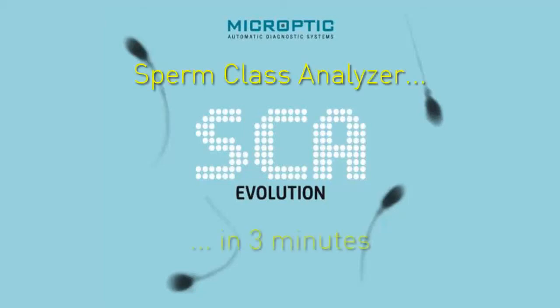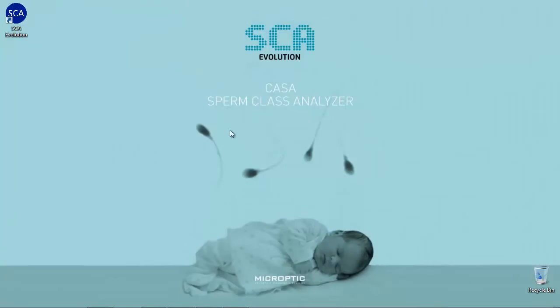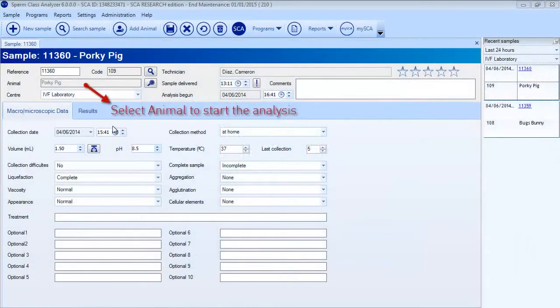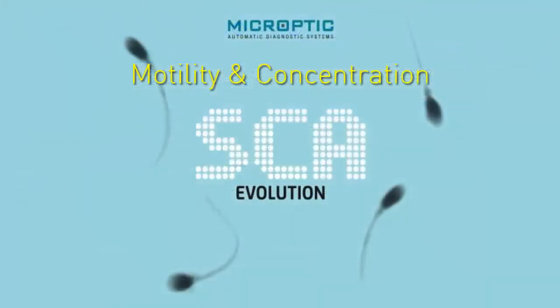In this video, we will see how to perform a full sperm analysis with Sperm Class Analyzer, the SCA program. First analysis is motility and concentration.